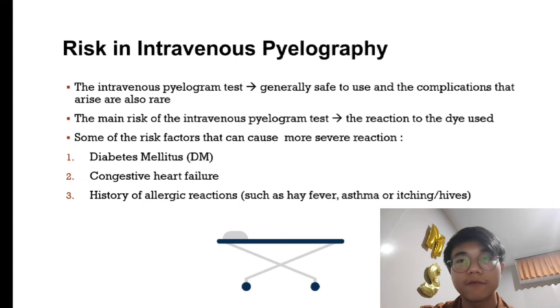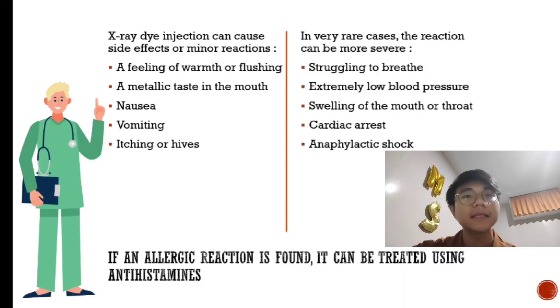Actually, the intravenous pyelogram test is generally safe to use and the complications that arise are also rare. The main risk of the intravenous pyelogram test mostly lies in the reaction to the dye used. Some of the risk factors that can cause more severe reactions are diabetes mellitus, congestive heart failure, and history of allergic reaction.